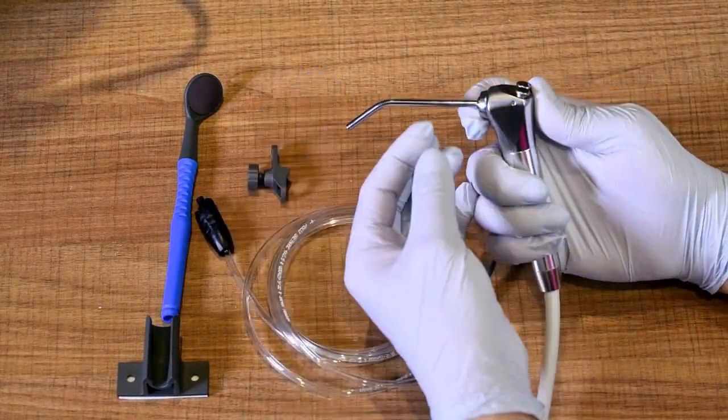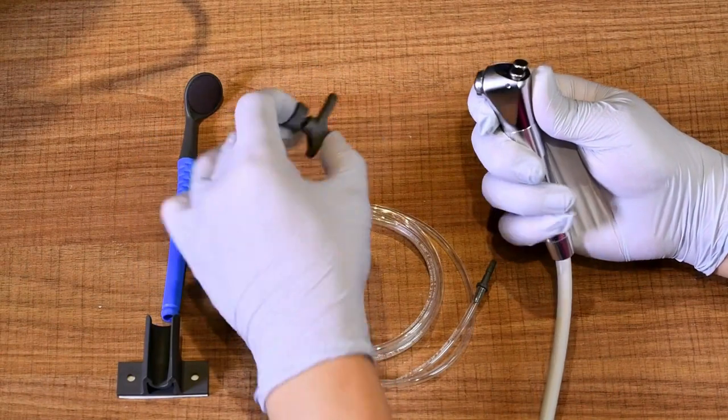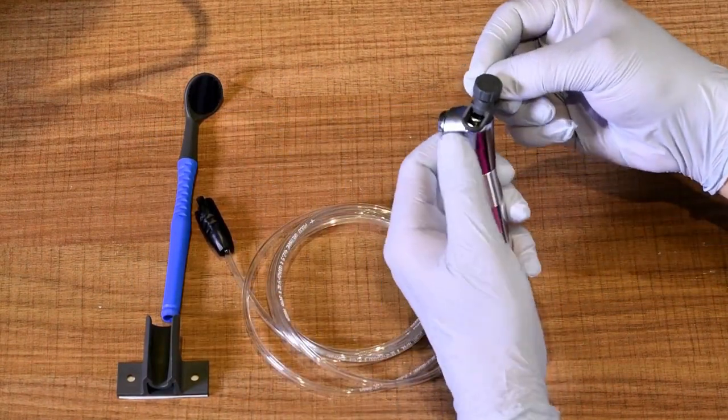First, we will show the air water syringe hookup. You clip the gray dial onto the air water. That dial will allow you to adjust the airflow.